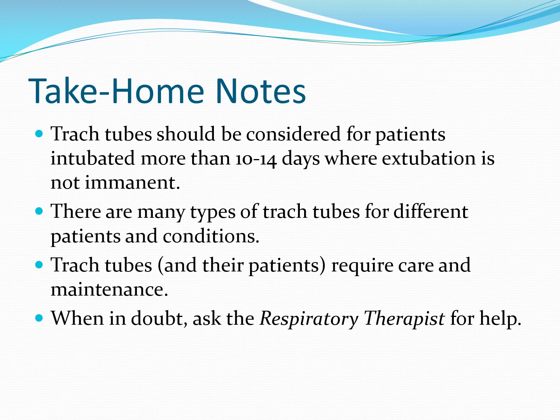So coming down the home stretch here, I'm just trying to take some of the key themes that we've gone over the past 45 or 50 minutes. The trach tube should be considered for patients intubated more than about 10 to 14 days, and where extubation is not imminent. Many types of trach tubes for different patients in different clinical situations.